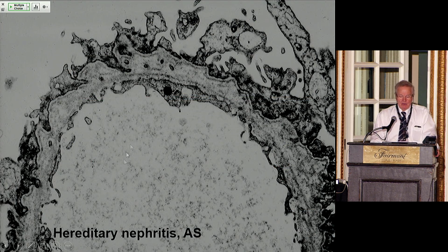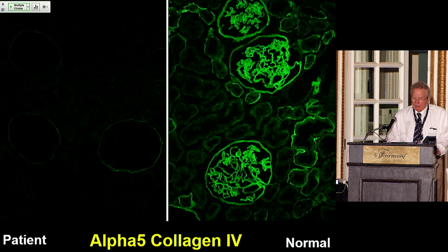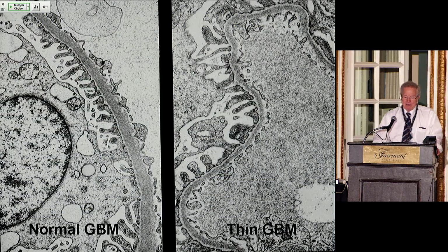This is the pattern that you see on the basal membrane with hereditary nephritis, Alport syndrome, X-linked type. You see the fraying of the basal membrane. There is no lamina densa left. It becomes a basket weave appearance. And the more common form is, of course, thin basal membrane disease. And this is clearly autosomal. The hematuria, persistent hematuria, gets inherited as an autosomal dominant effect. The chronic kidney disease as an autosomal recessive.